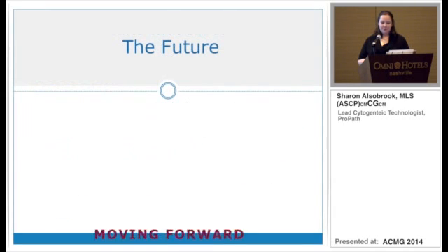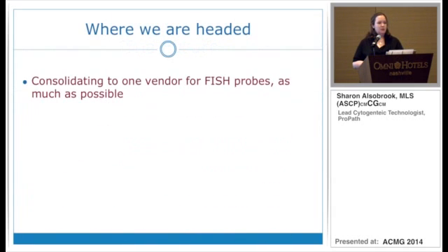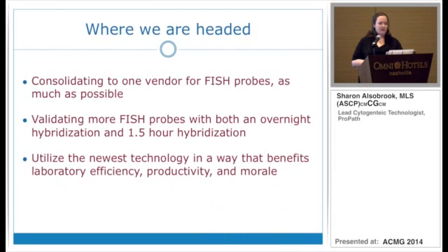So, as we're bringing on more probes, we want to consolidate down to one probe vendor. That just makes common sense. We want to consolidate purchasing as much as possible, especially considering I'm in charge of purchasing. And we're trying to get more and more probes on the hour-and-a-half hybridization. I really want to get to this.